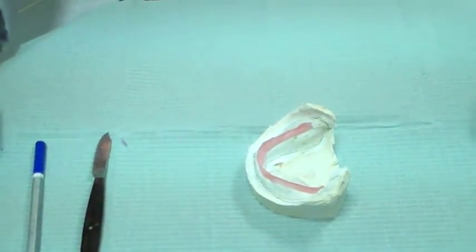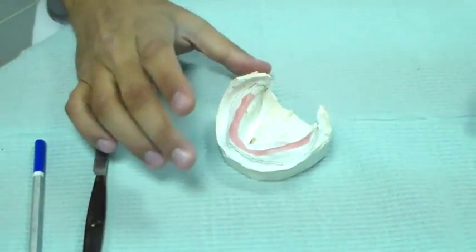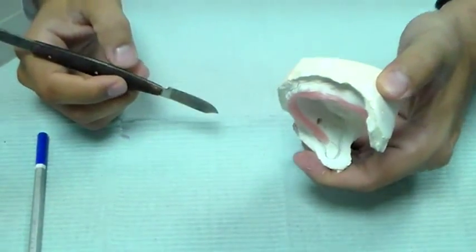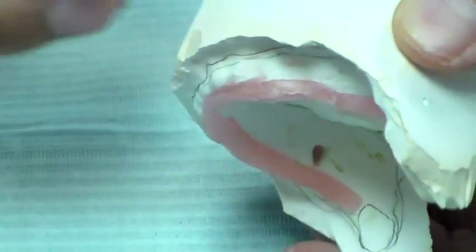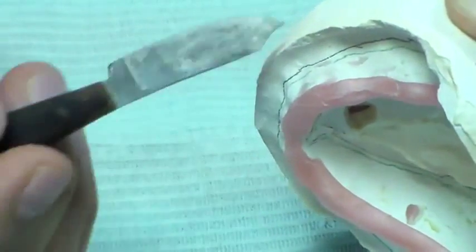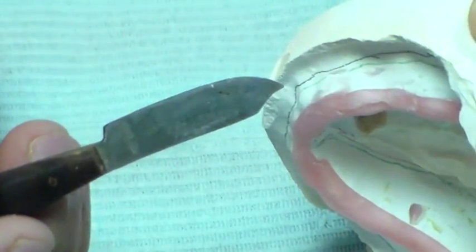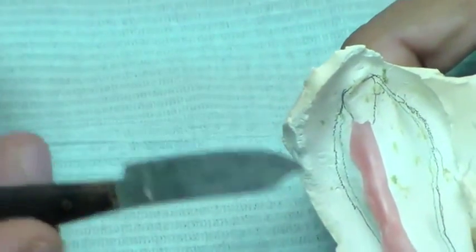Today we are going to make the mandibular special tray for final impression. I have a cast ready here — a primary impression cast — and I have made two lines. There is a black line at the depth of the vestibule, and the green line is slightly above, about 1.5 millimeters above the depth of the vestibule, and I have run this all through my buccal shelf area.